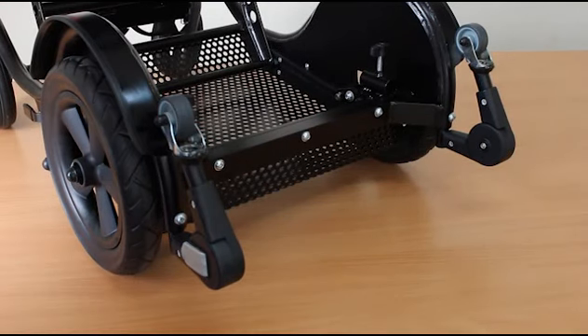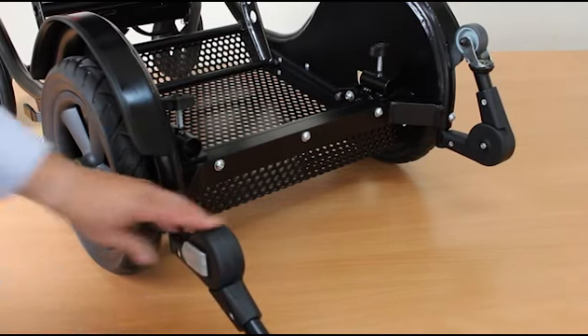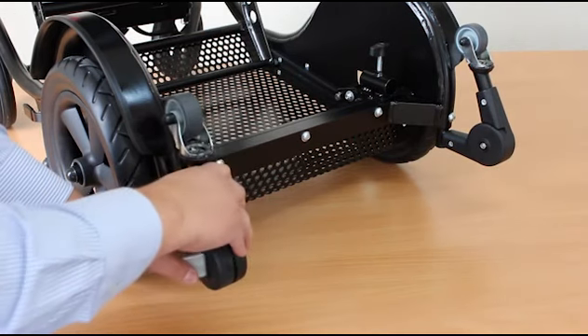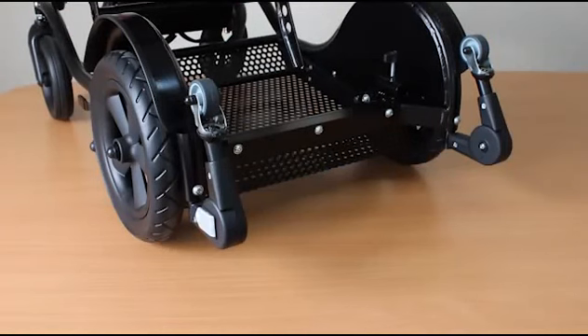At the rear we have additional stabilizers, which can be placed out in position like this if the weight of the child in the rear seat is beginning to equal the weight of the child at the front seat. This is a useful accessory feature that will help prevent any tipping rearwards.